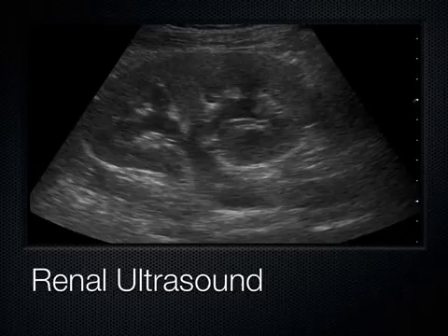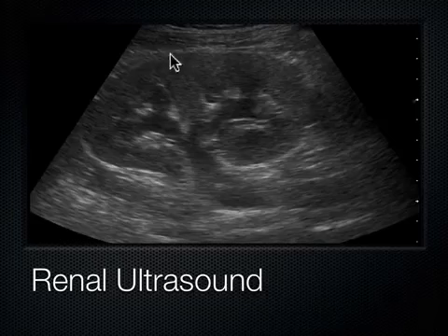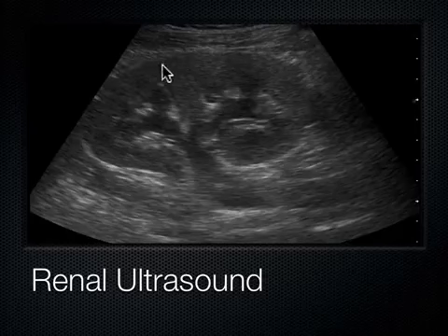And you could tell from this image right here, I don't know if you could tell, this is a kidney. And the kidney has some anatomy to it I'll go over. This is the capsule of the kidney out here. It's a very thick fibrous structure, and the capsule does not allow the kidney to expand very much. And so when somebody has a blockage of the kidney, like a kidney stone, there's really nowhere for the kidney to go to expand, and so that's why people get excruciating colicky pain with kidney stones. It's because of this capsule, this thick structure out here.